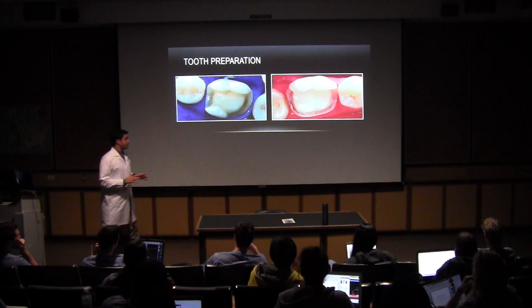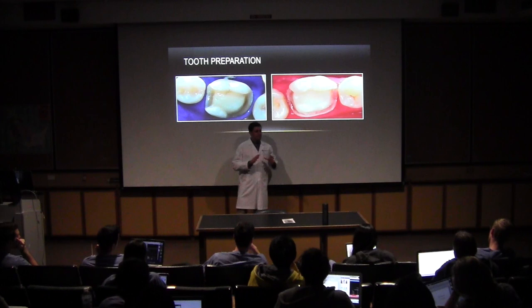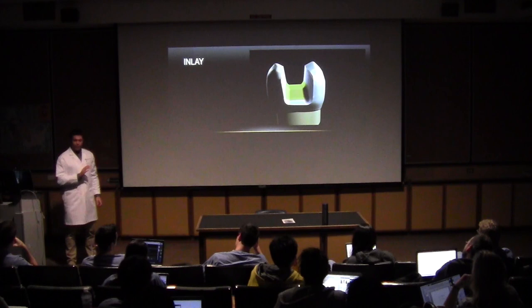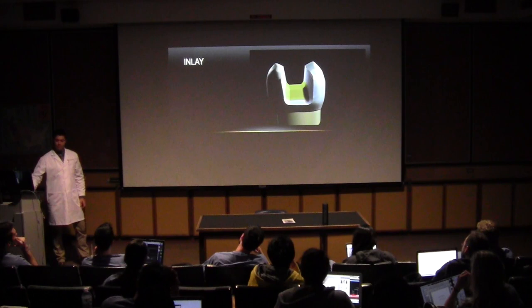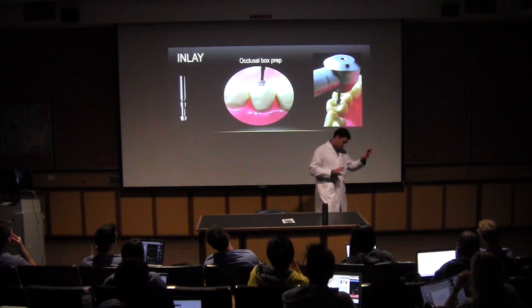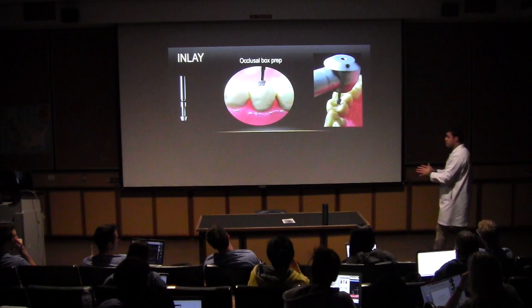But to get a prep like this one, we have to work with the exact instruments, right? You have to use the manual instruments and the appropriate diamond points. Let's see the step-by-step to do a prep like this. The first one we're going to start with is the inlay prep. Always think that we start from an inlay prep. If we're going to do an onlay preparation, the first thing is an inlay prep.